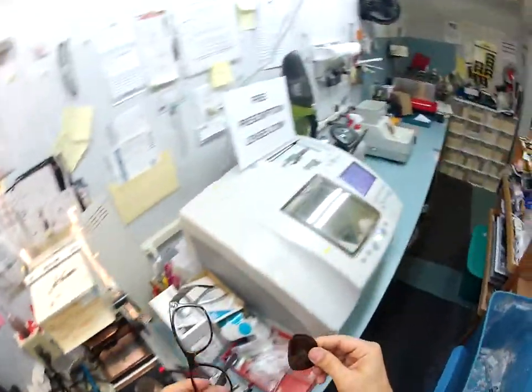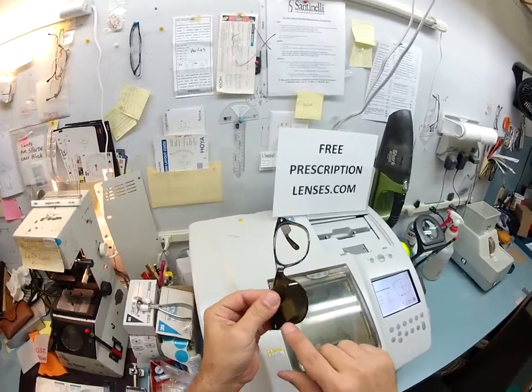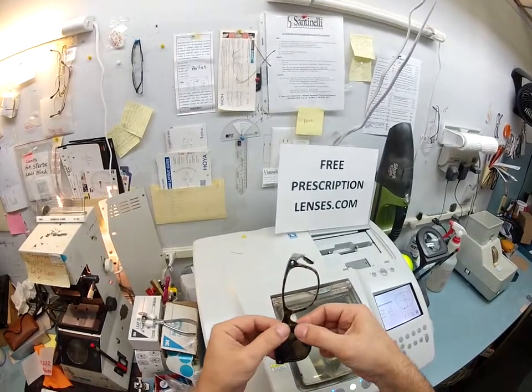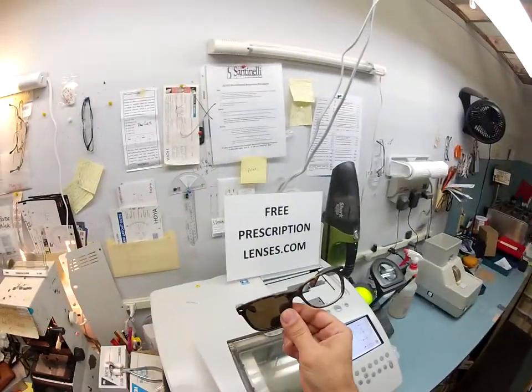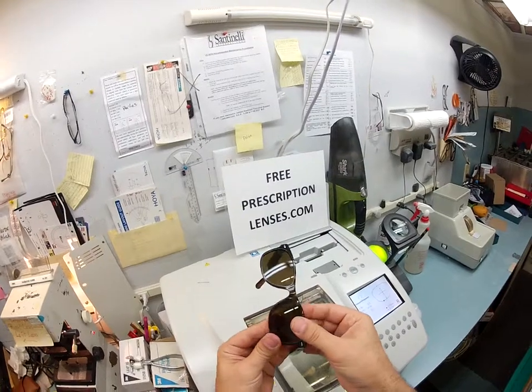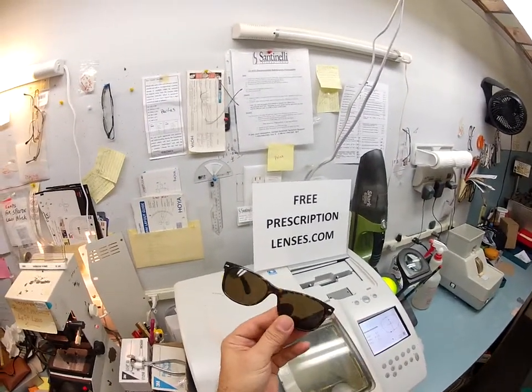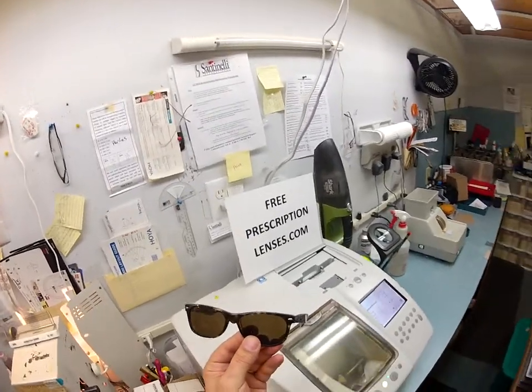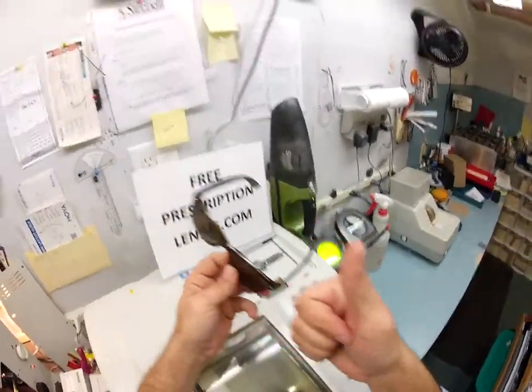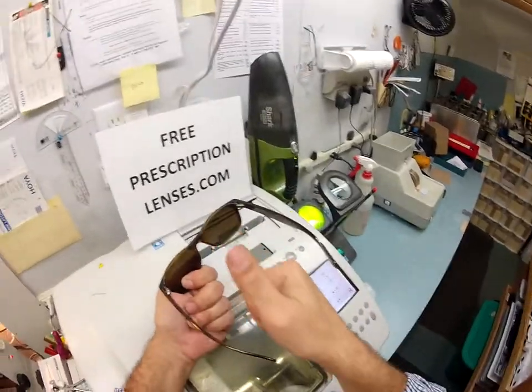So in order to insert your lenses, you tuck them in at the outer corner, which is closest to me, and then using your thumbs, you push down at the nose, they snap right in. I rotate the frame around so the empty side is closest to me. Same thing again, I tuck it in at the closest side, and using my thumbs, press down at the center, it snaps right in. Now to take it out, it's always with your thumb, it's always at the nose. No matter what direction you're doing, you're always pressing down with your thumb.